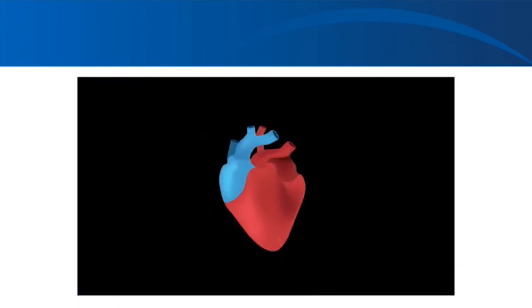There are 3 important planes of imaging for the heart. One is sagittal, the other one is transverse, and the other one is coronal. The important thing to note is that the heart is aligned slightly oblique when compared to the body's long axis. So the body's long axis is like this in the vertical direction, and the heart is aligned obliquely in this direction. And knowledge of these planes will help you get an idea of what chamber is on the top, what chamber you are viewing in what echocardiographic window. We'll discuss these things in detail in the next slides.